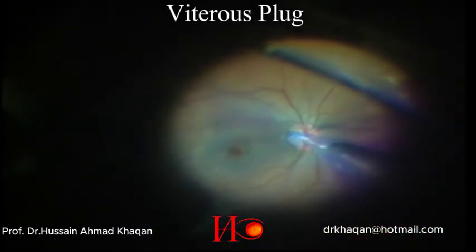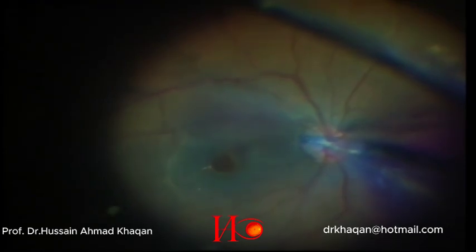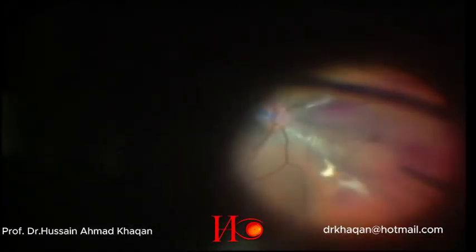Here you can see that the vitreous is completely plugged in the optic disc pit. I am trying to remove this vitreous plug, but as you can see I was unable to do so. So I decided to remove all the posterior hyaloid that has been detached.